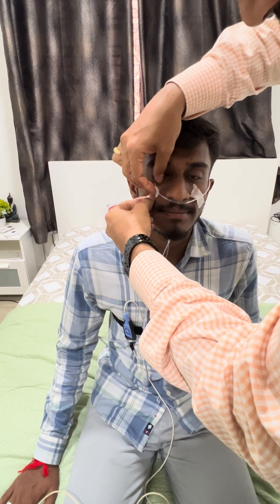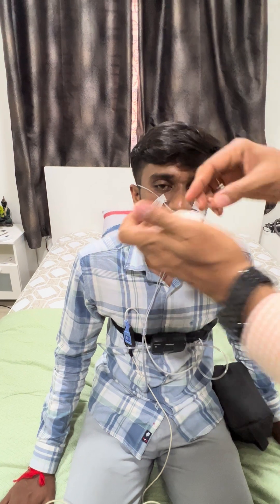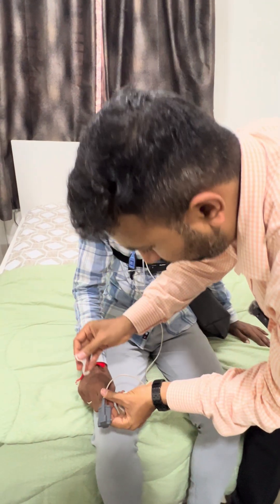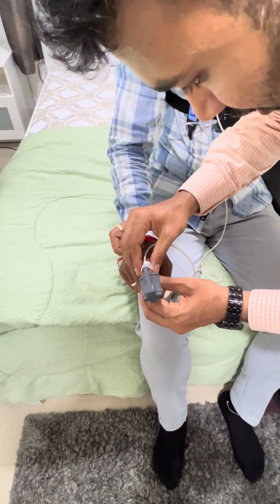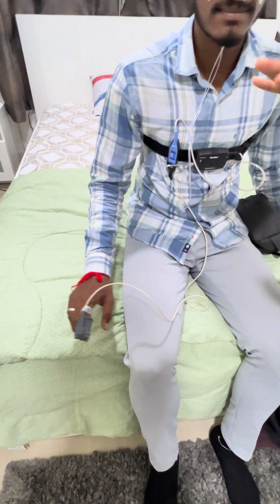Also apply one piece of micropore to the finger so that it holds tight and the oximetry probe doesn't come out.